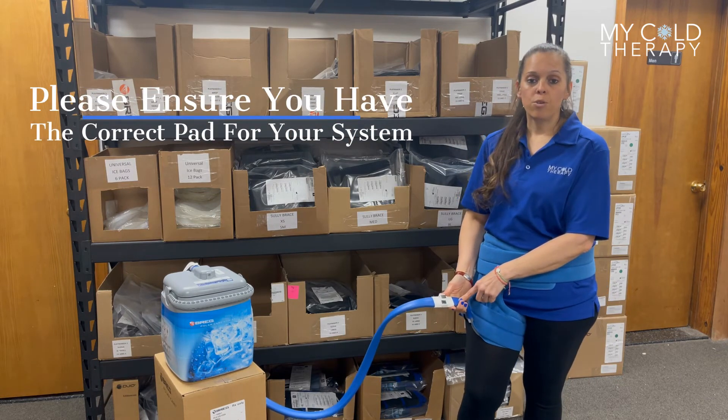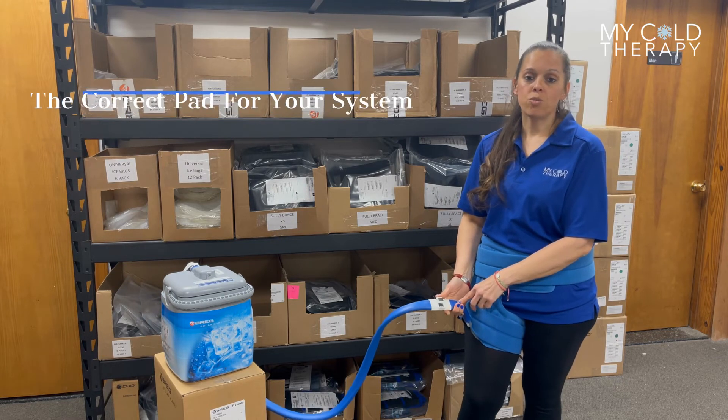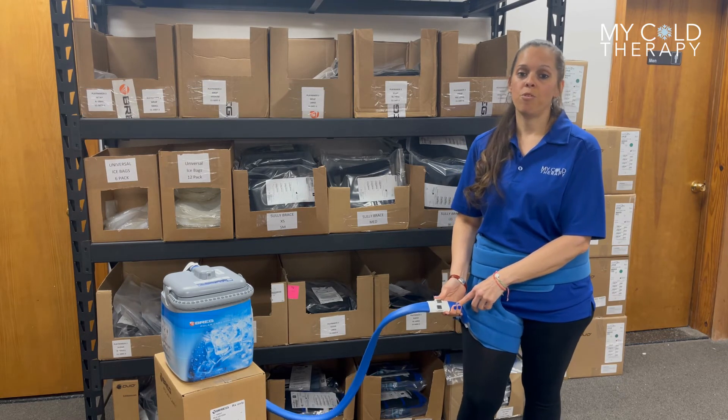Now keep in mind, the Kodiak pads are not interchangeable, so always make sure of which system you have before you order your pad.